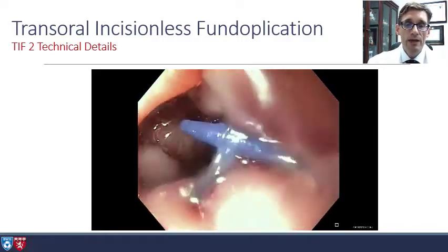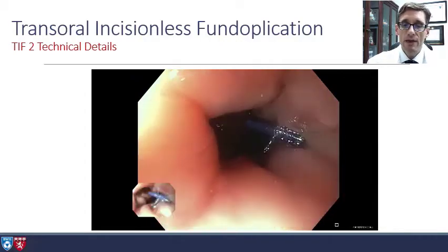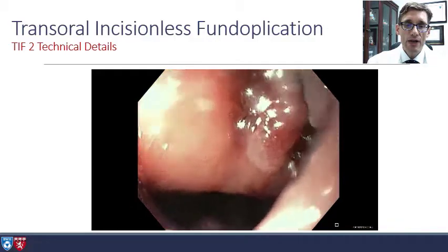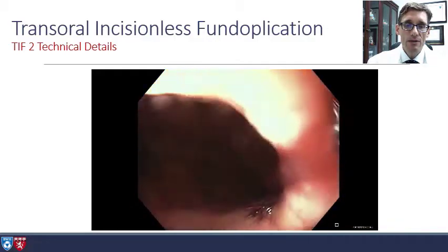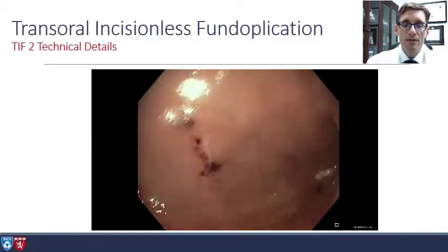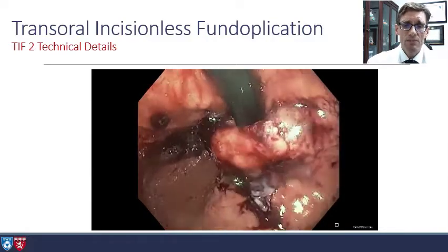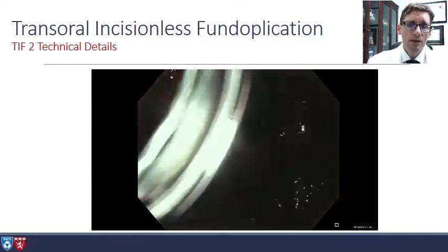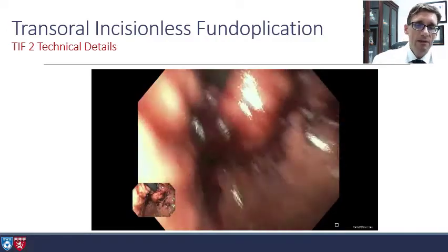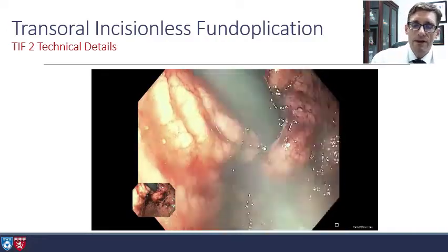Afterwards, it's a little tighter going through this GEJ. You can see one of the H fasteners — certainly more snug. Then going into retroflexion, you'll see that nice 270-degree valve, nice and plump. This patient did very well, and this is a very typical appearance following the procedure.